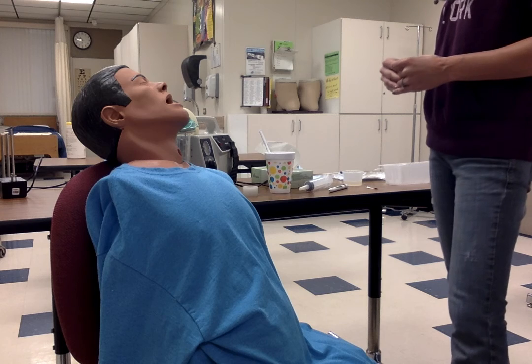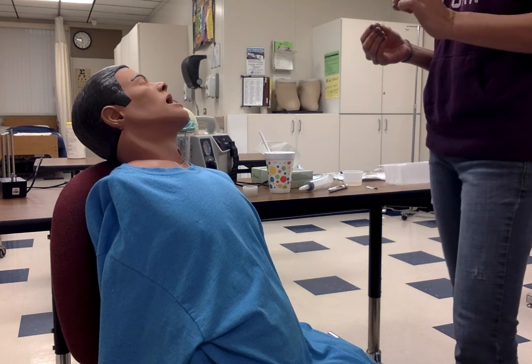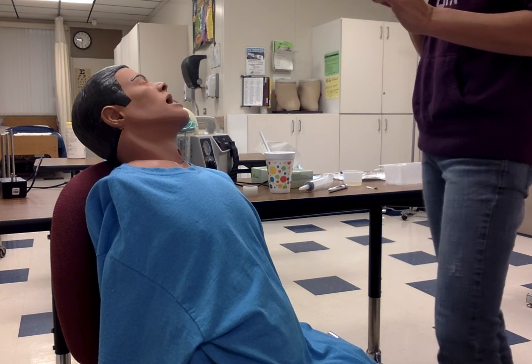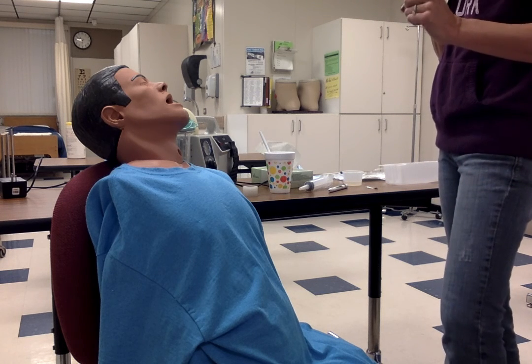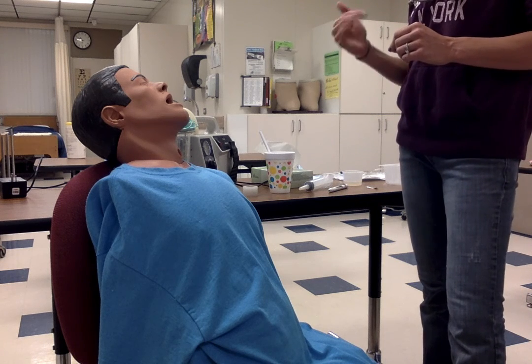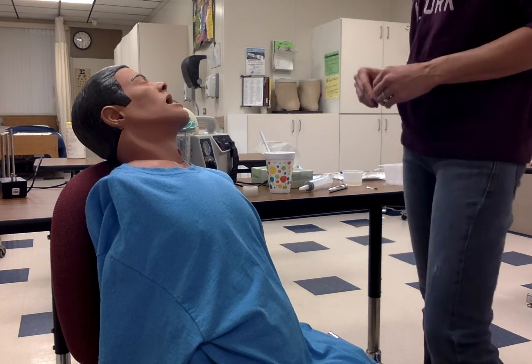So I also want to explain to the patient that we're going to tilt the head back a little bit. I'm going to insert the tube to about the end of the throat. And then I'm going to have you tip your head down. We're going to go chin to your chest. And then as I'm inserting the tube, I'm going to be giving you water to drink through a straw, and you're going to want to drink and drink and drink. And that's going to help you swallow the tube better, and it'll go down more smoothly. So just making sure that my patient is able to help with that kind of stuff.